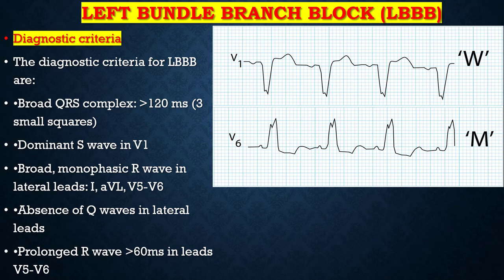Broad monophasic R wave in lateral leads aVL, V5 and V6. I will show you this in the next slide. Absence of Q wave in lateral leads and prolonged R wave peak time of 60 milliseconds in leads V6 and V5.